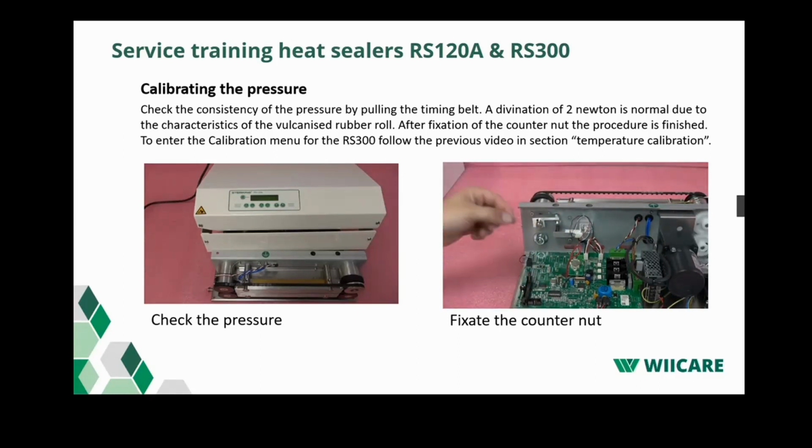If this is the case, remove the jumper and reassemble the hood.